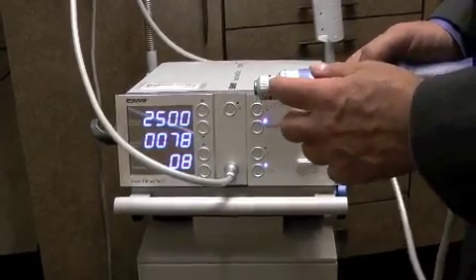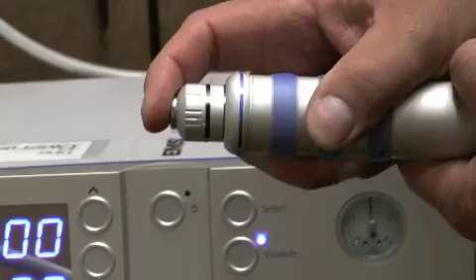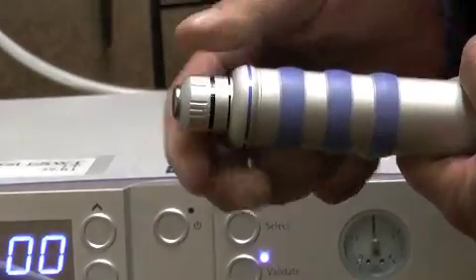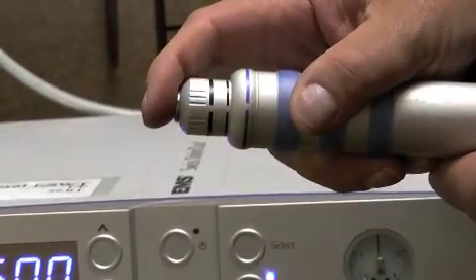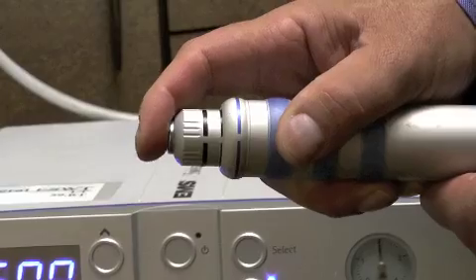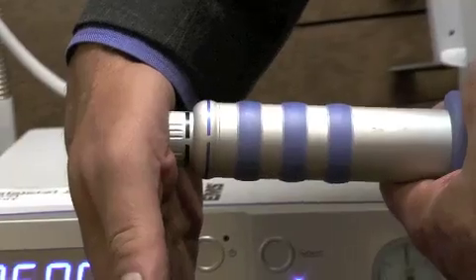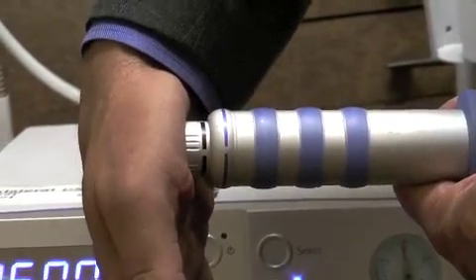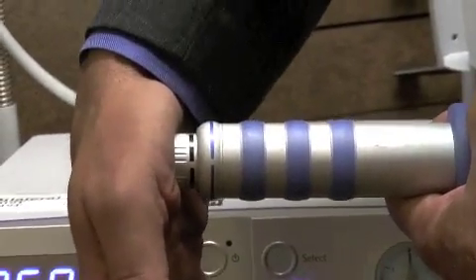Now, very important to look at this particular area. You can see as I push this down, the cylinder goes down and there's 2 lines. A line down lower here and a line higher. You want to press it so that somewhere between the 2 lines is where the force is. So when I push on my hand, it's somewhere between the 2 lines that you'll be doing it. Don't go all the way to the top, but somewhere between them.